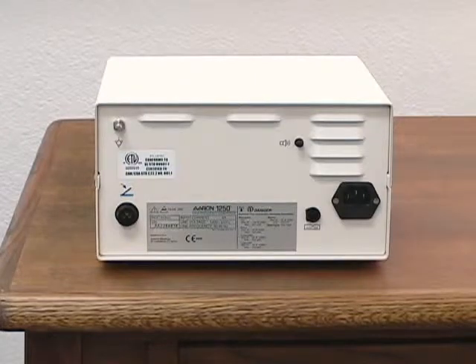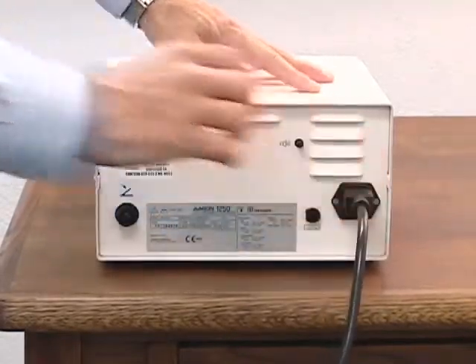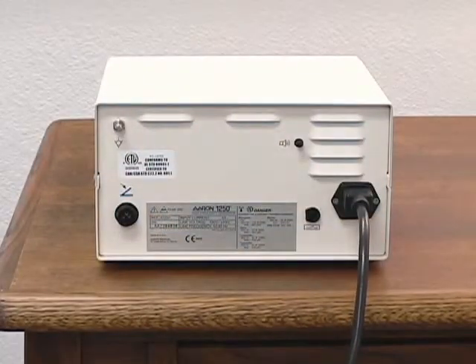To attach the power cord, place the unit on a sturdy, flat surface. Ensure that the power switch is in the off position. Insert the hospital grade power cord into the back of the unit and the other end into a properly grounded AC outlet.